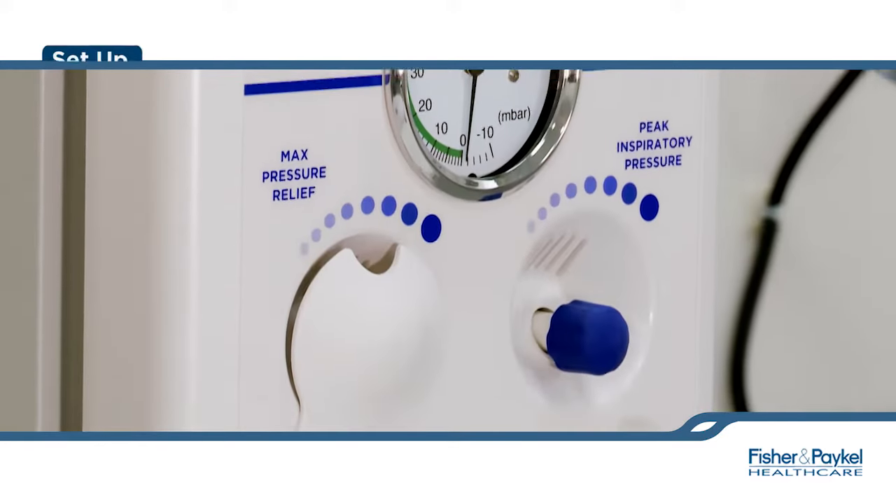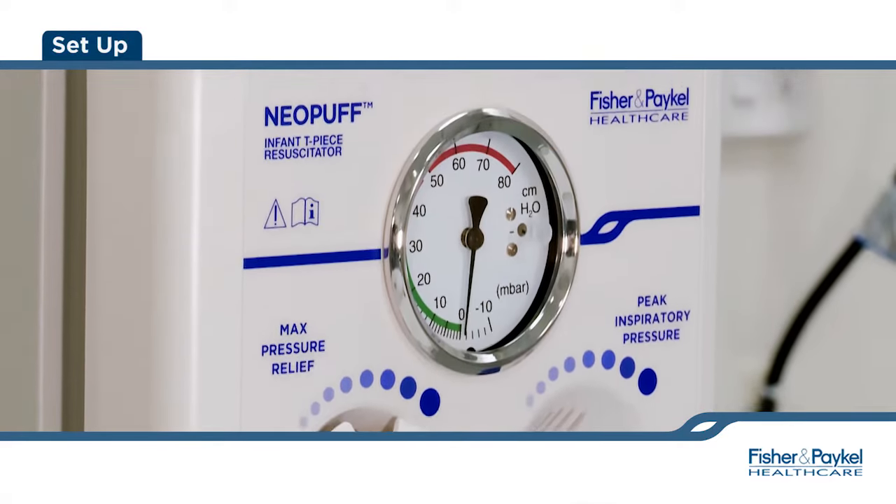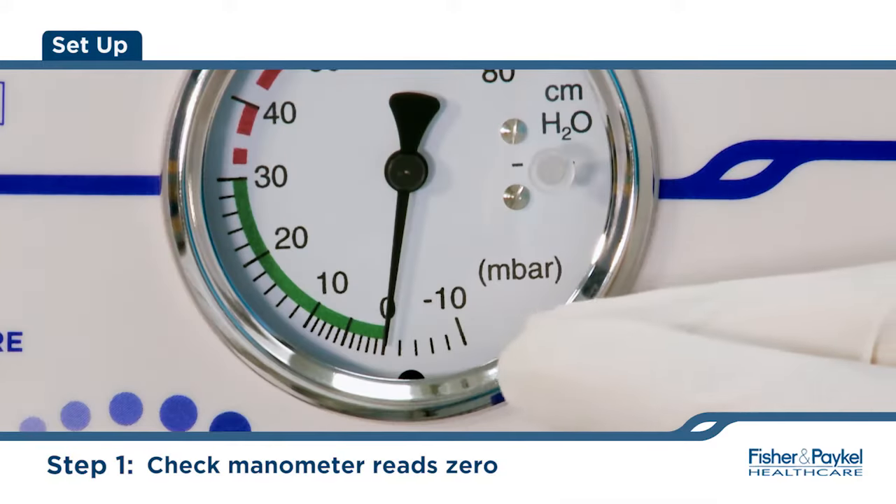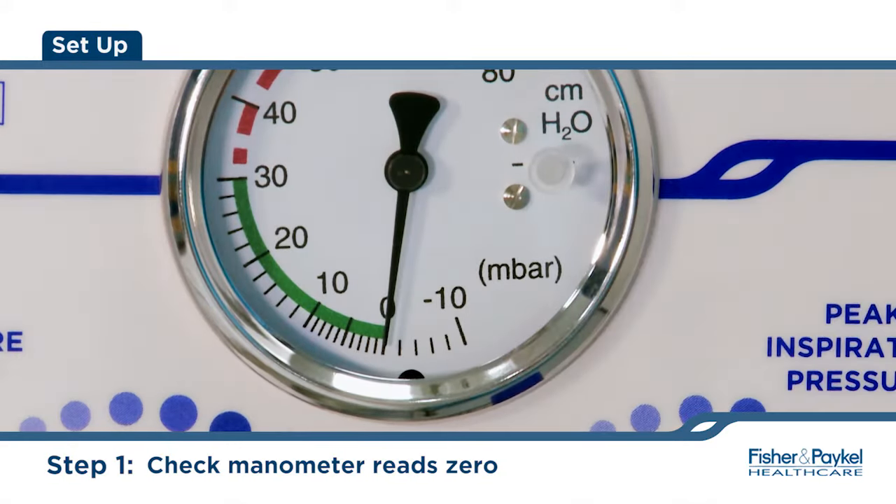The following procedure should be carried out prior to every use of the Neopuff to ensure that the device is functioning correctly. Check the manometer reads zero with no gas flow. If not, the manometer requires calibration.